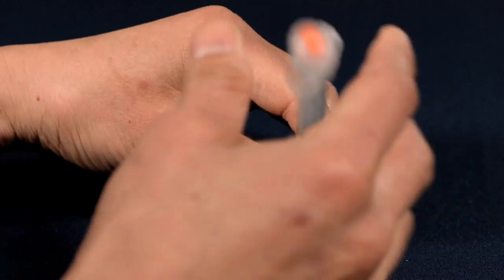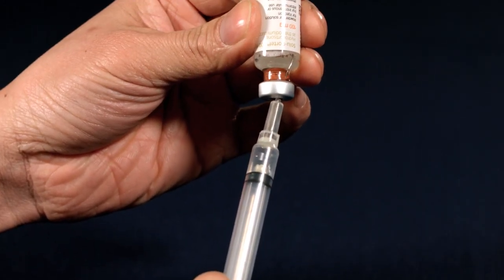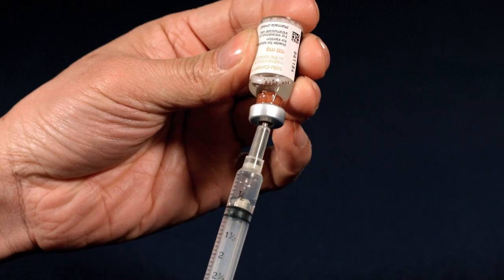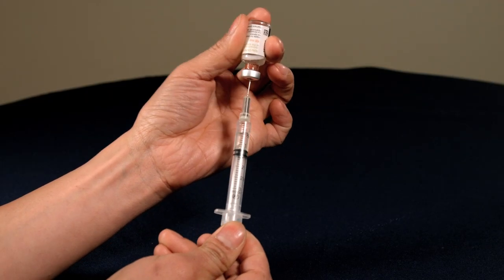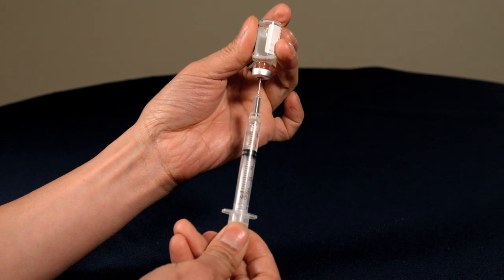Tip the Solucortef bottle upside down, drawing up all of the solution into the syringe. Make sure the needle stays below the surface of the liquid.